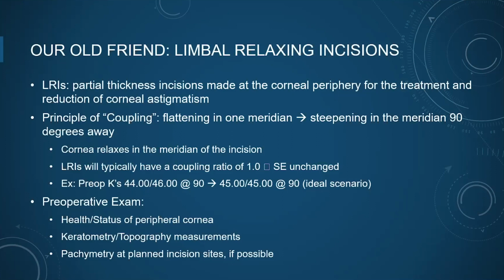So it's important that if we are going to venture into the world of limbal relaxing incisions, the preoperative exam isn't that much different than what we would do for regular cataract surgery. We certainly want to do a good exam, look at the peripheral cornea, and make sure there are no things like Salzmann's nodules or thinning from PUK or Terrien's marginal degeneration. So make sure the peripheral cornea is healthy, and get keratometry and topography measurements. Topography is very important to make sure there's no irregular astigmatism.